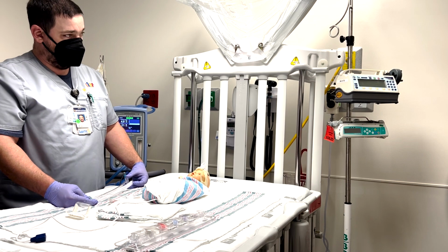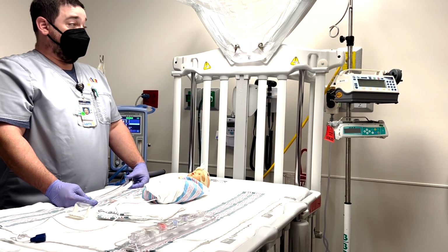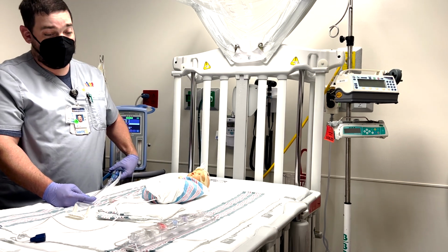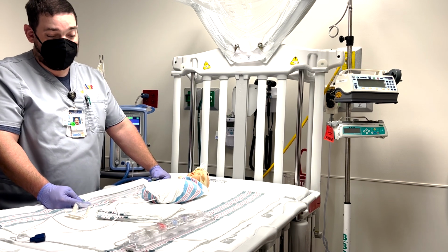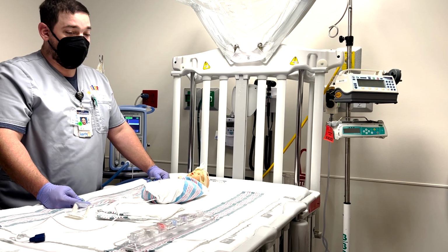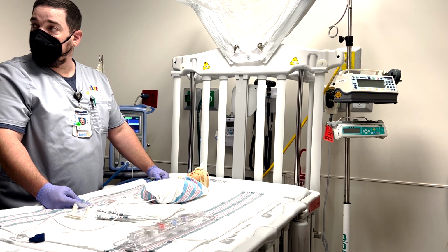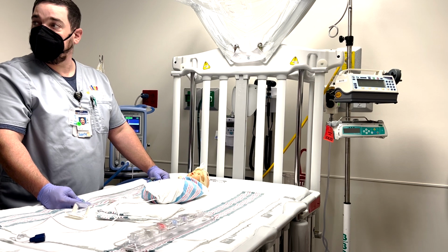Do you recommend still suctioning just as frequently? As needed only. And that's CPAP, especially in the setting of RSV bronchiolitis, rhinovirus. The thing that should come in handy here is we use less suction. The airways are going to be more open, so there's less chance of occlusion from all that suction, not the suction, the secretions.